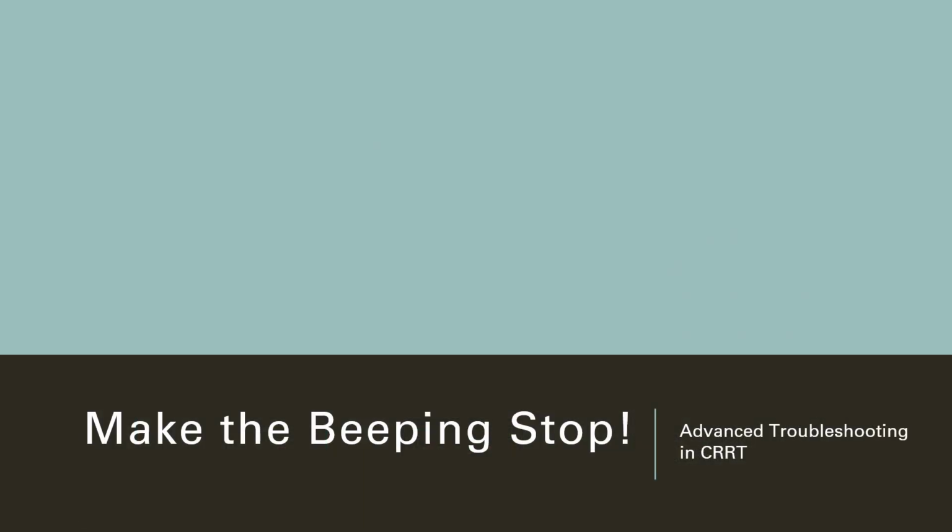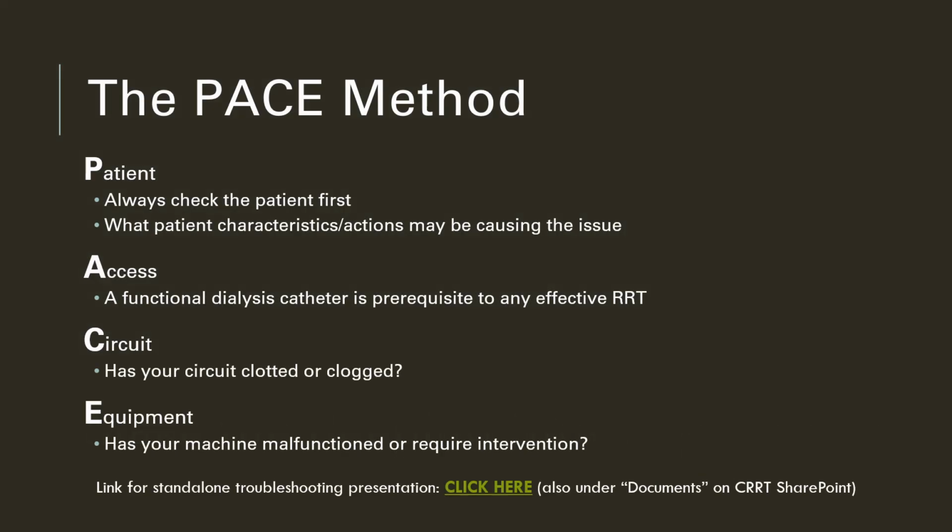Next, we'll talk briefly about troubleshooting. The troubleshooting method that we teach in new hire class and that we reinforce in the SuperUser class, which we are recapping today, is the PACE method. PACE stands for Patient, Access, Circuit, and Equipment. Whenever you're having trouble, first assess the patient. Are there characteristics of the patient that may be causing the issue?